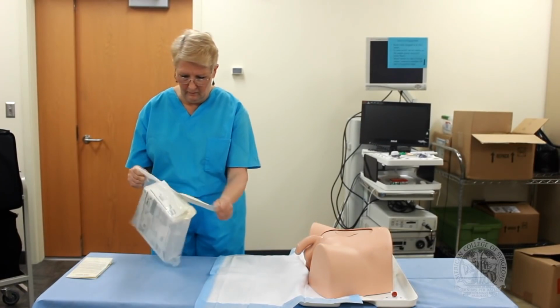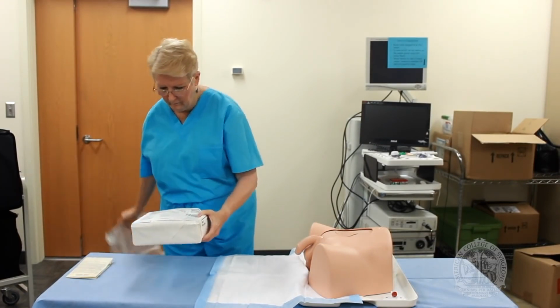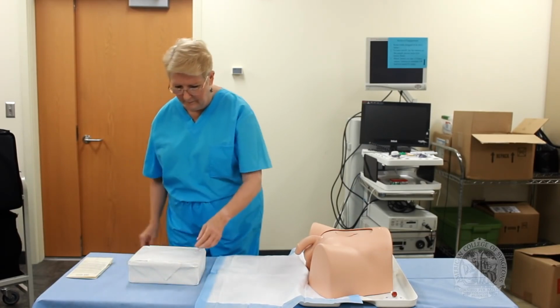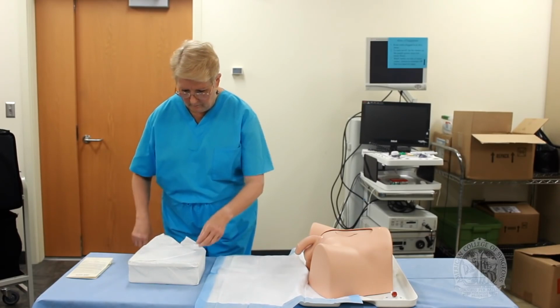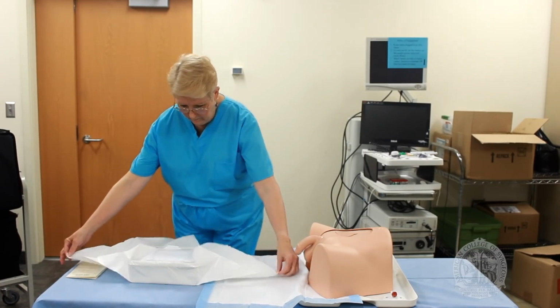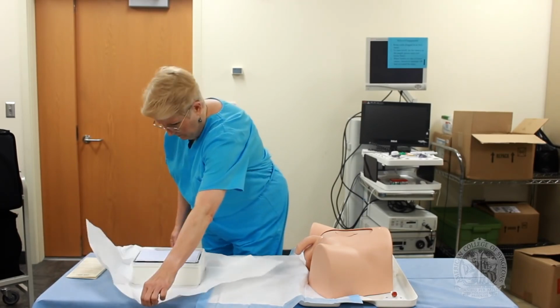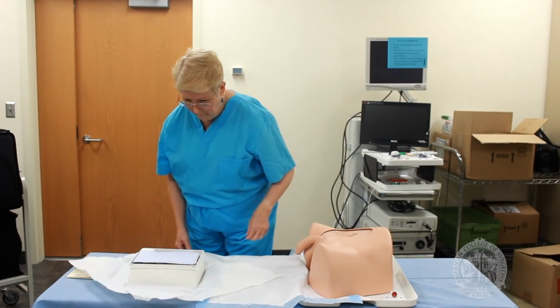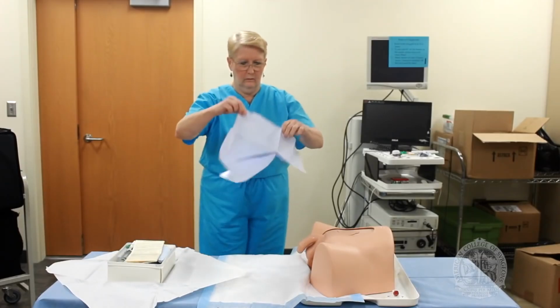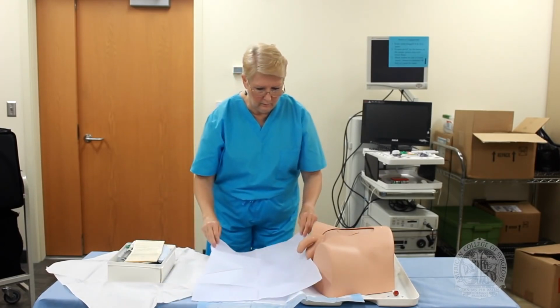Now that the penis is washed, it's time to move to the sterile portion of the procedure. Open the kit to set up your sterile field near the patient. Make sure to place the sterile field in an easy-to-reach location that ergonomically works for you. You will be doing most of the work with your dominant hand, so that should be the side closer to the field. An easy place to put it is on the patient, just next to the sterile field. Place the large square drape across the thighs and under the penis.